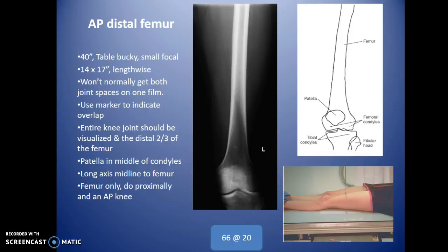For the AP distal femur, we go from the knee and get up as high as we can towards the thigh, then do an AP proximal femur. Use a lengthwise cassette at 40 inches. Use a marker to indicate overlap — place your marker up high so that when you do the AP proximal, you have a little bit of overlap. If your marker is in there, you'll know you have the entire femur without missing any part of the mid shaft.